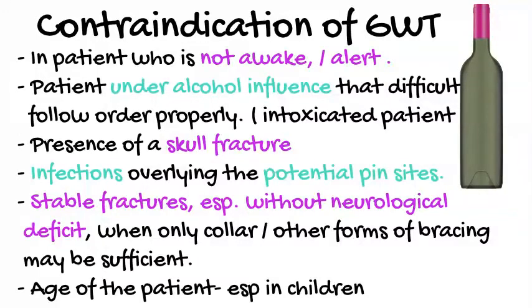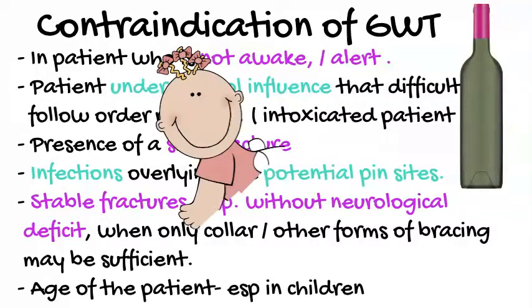In a stable cervical fracture, especially one without neurological deficit, when only a collar or other forms of brace may be sufficient, Gardner-Wells tongs are not indicated. Another contraindication is the age of the patient, especially in children.